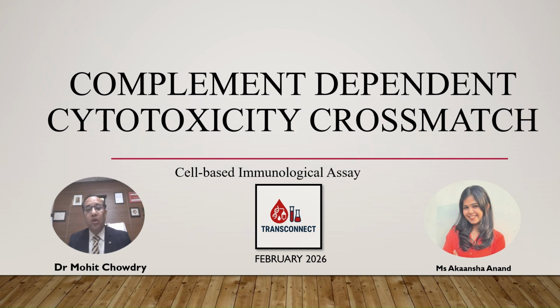Another important thing is you can do a titered crossmatch also to look for a prozone phenomenon, or report the titer itself to see at what titer it is giving the highest positivity. That will help us know, when you repeat the crossmatch next time, whether the antibodies are decreasing or are at the same level. So this CDC crossmatch gives you a lot of information. It tells you the complement-acting antibodies, and also it is a gold standard or a mandatory test before we proceed for the transplant.